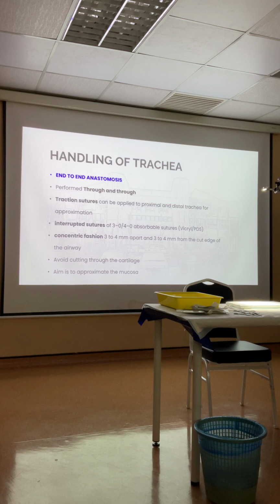So that you have an iso-volumetric suture. You don't want to suture the left side first and then suture the right side, because if there's a volume mismatch or a cross-sectional area mismatch, then you can adjust it as you suture together, left and right, left and right, left and right, until you reach the back. So you can adjust the volume discrepancies between the distal and also the proximal trachea.